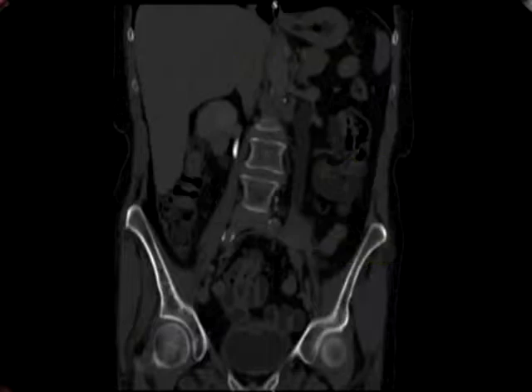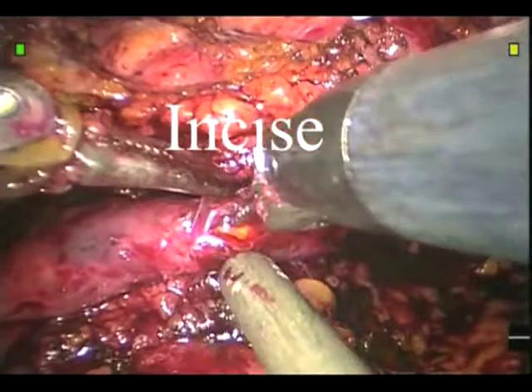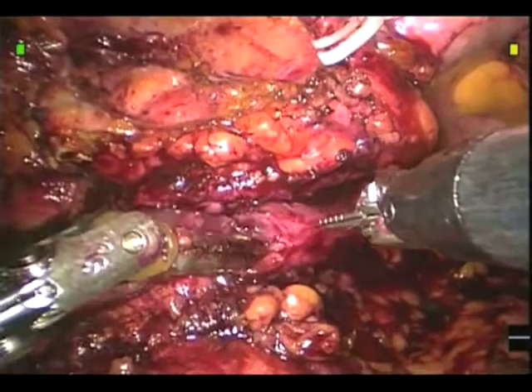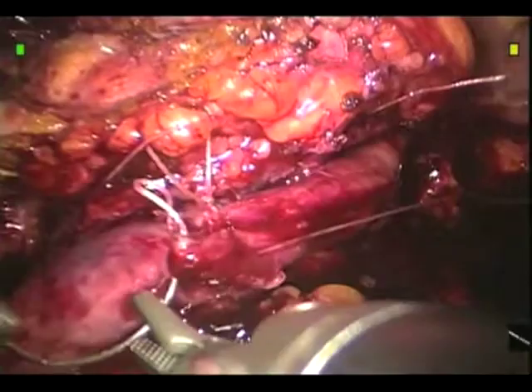We pick up the operation after the ureterolysis has been performed. A stricture is evident and a decision is made to incise it longitudinally. Here you see the stent within the ureter. We then close it horizontally using the same principle as the Heineke-Mikulicz. The suture utilized is a 4-0 on an RB1.